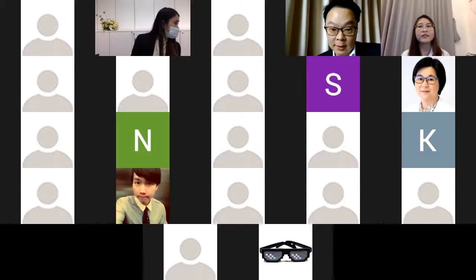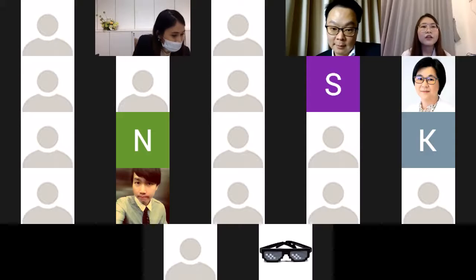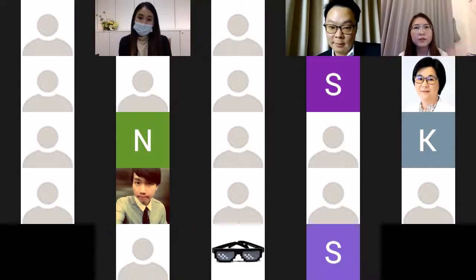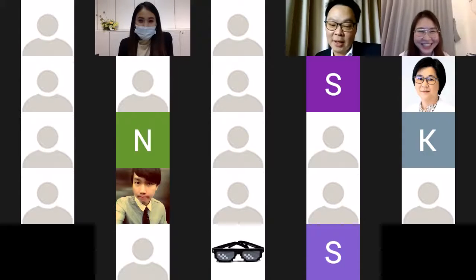It will be better because in a 3D image you can see not only the anteroposterior aspect, but also the buccolingual aspect, because some root angulation we don't see in panoramic. Okay. Because in 3D you can see all aspects. Okay, so it's better.